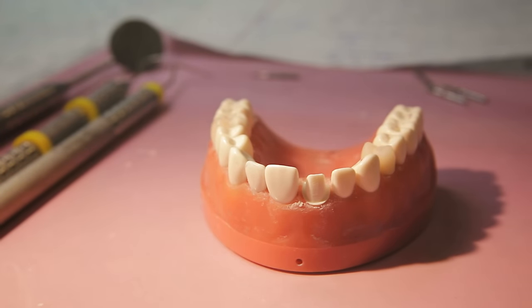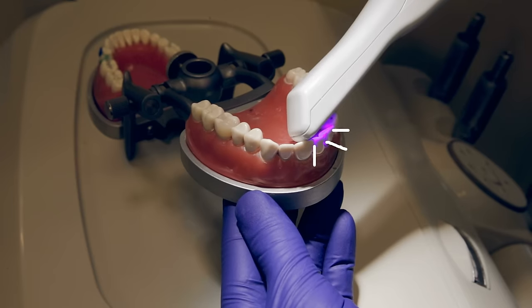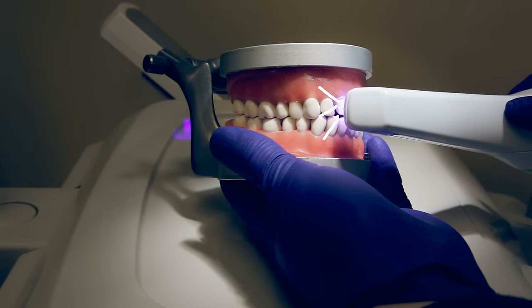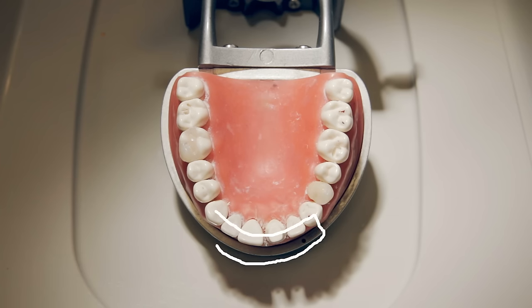Now that the tooth is ready, you can isolate in preparation for scanning. You can use something like an OptraGate or an IsoVac. It is important to have a path in mind for when you are scanning — this will allow you to be efficient and to have a clean scan. Start occlusally and work towards and past the prep tooth. Rotate the tip buccally and move back towards the initial point of scan. Rotate onto the lingual and work towards and past the prep tooth.